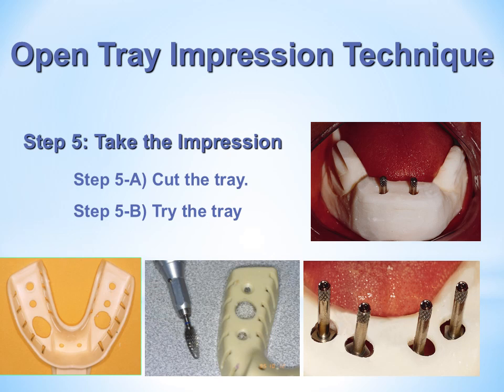Then we prepare the tray that has enough opening for the impression posts and does not interfere with them.